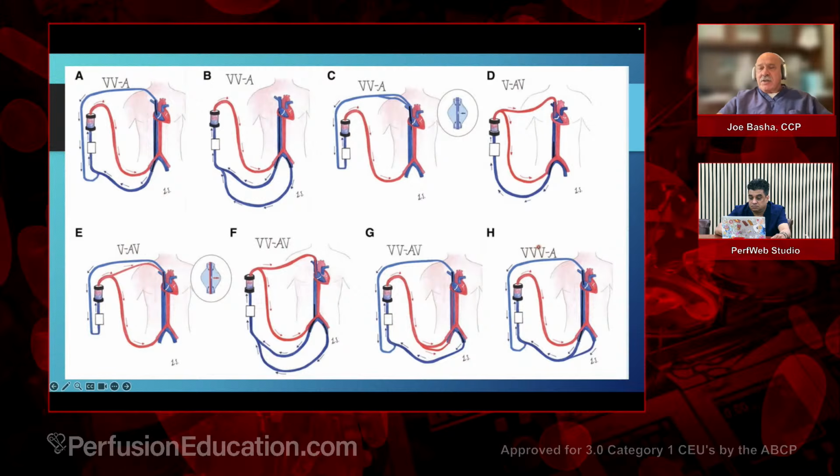And then here, you really needed a lot of venous drainage, so you have bilateral venous femoral access. You have jugular or superior vena cava drainage, so VVV oxygenator and 1 arterial return. So those are some interesting diagrams, gives you an idea, and it goes straight back to what I was talking about before. It is a circuit.